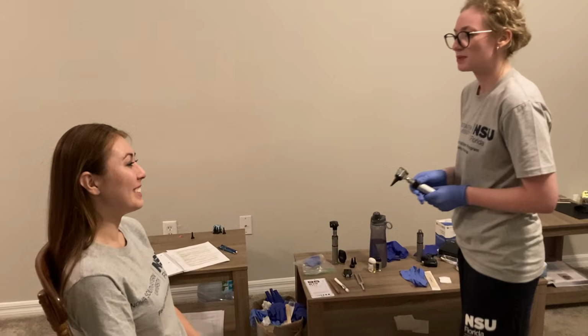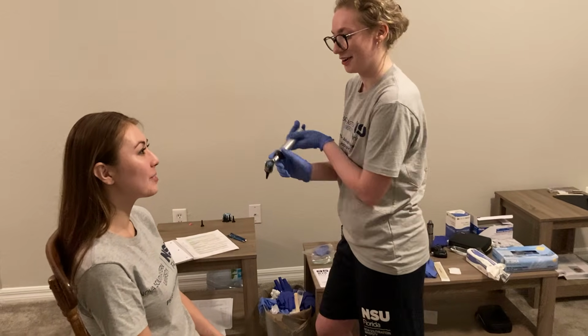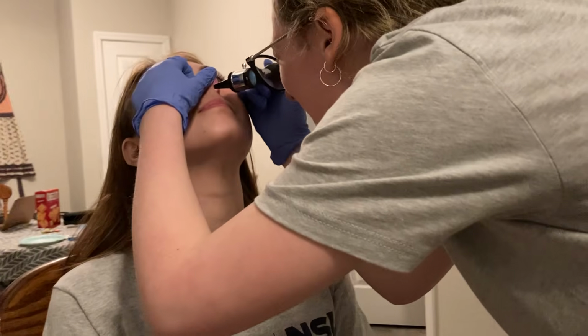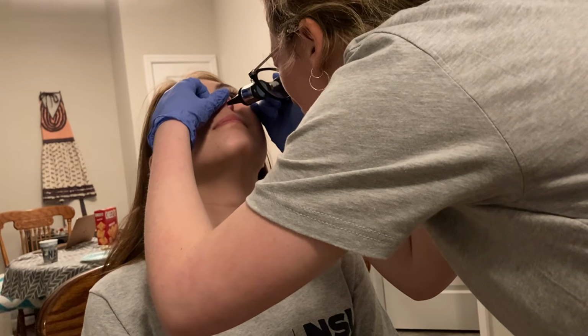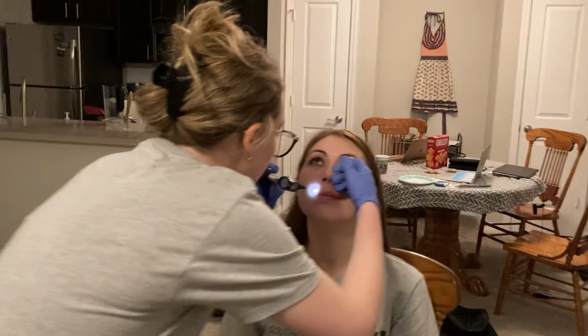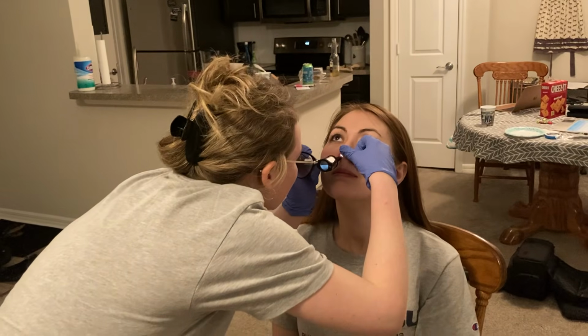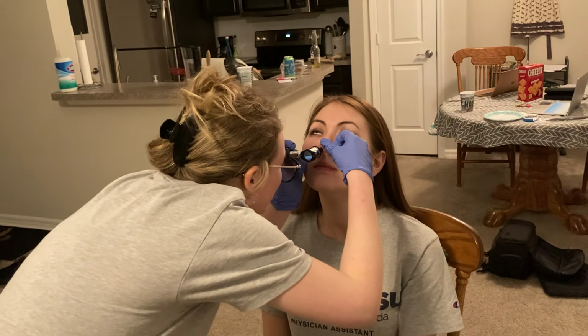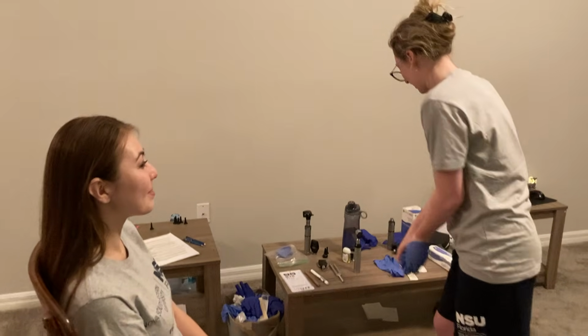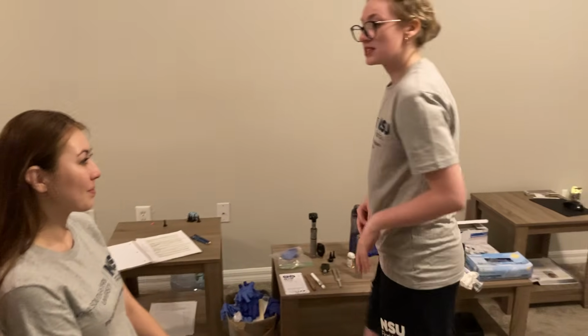Okay. So this brings us to. Okay. So what I'm going to have you do is kind of. Perfect. Exactly. Okay. I'm going to insert this. All right, and slowly put your head down for me. Slowly, beautiful. All right. Same thing on the other side. Again, inserting. All right, slowly put your head down. Beautiful. Okay, so the nasal mucosa is very pink, very moist. I don't see any lesions. Nose is great.